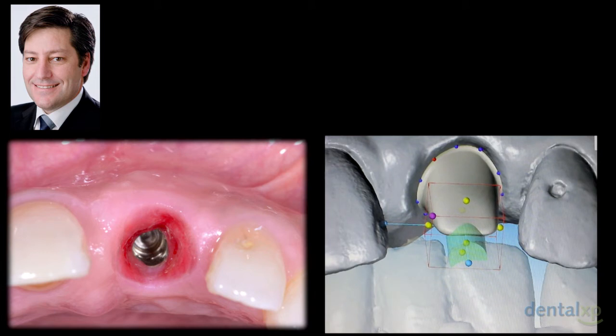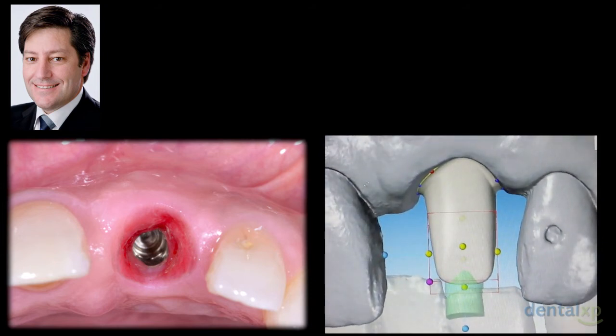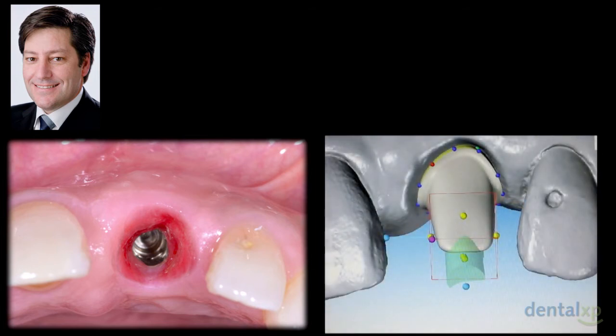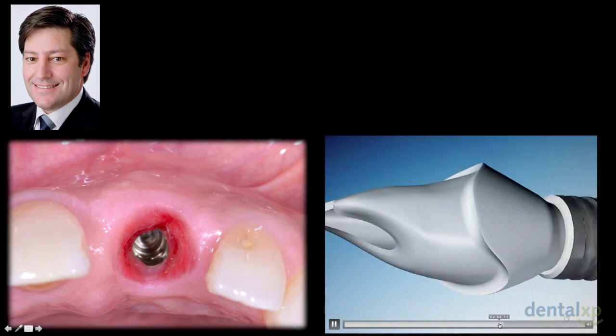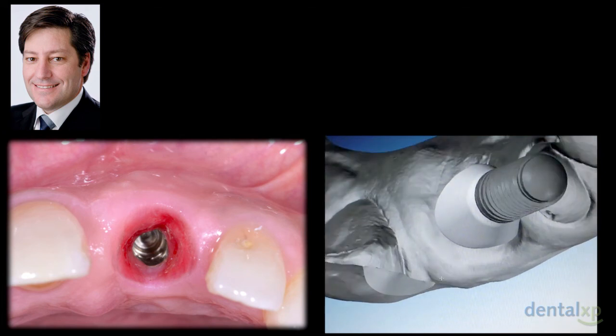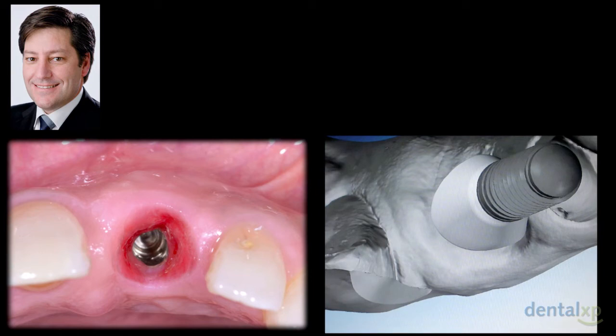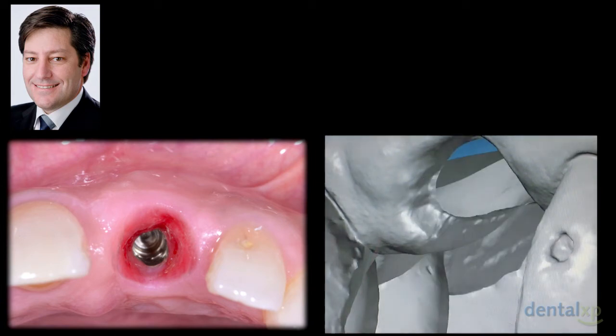But the whole fabrication of any of these CAD/CAM systems, this is not particularly this one, any one that you use, within 2-3 minutes, you will have the design of your abutment ready. And then, of course, you can do all the modifications and send it out until you can get your abutment like this. You see, now I have followed completely the emergence profile that I showed you in the presentation. I know that my margins are slightly subgingival for the removal of the cement, and at the same time, I have supported all that structure with the custom abutment. This is particularly important in the aesthetic area.